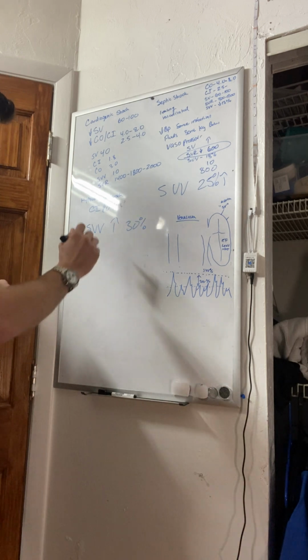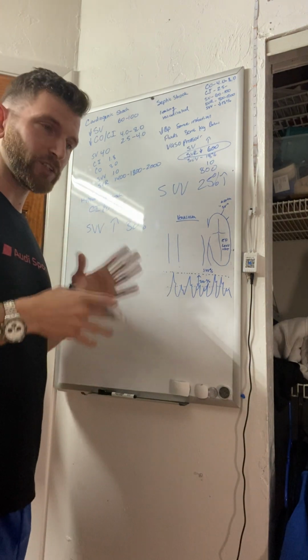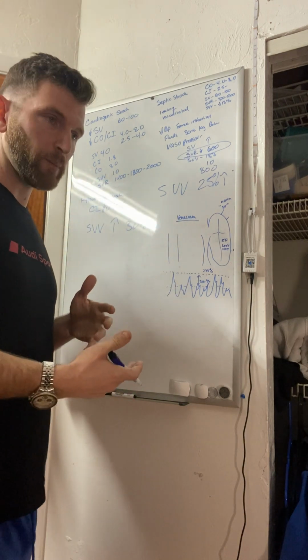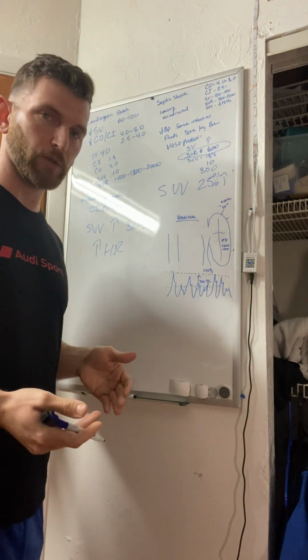They could be either, but your SVV is going to be through the roof. And the cardiac index, output, and stroke volume may actually be just fine, but what you may see instead as a compensatory measure from the body to try to help fix the situation is you're going to see an elevated heart rate commonly, unless they're on beta blockers or something like that.